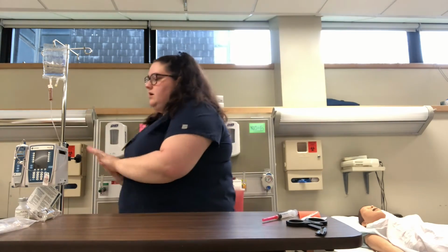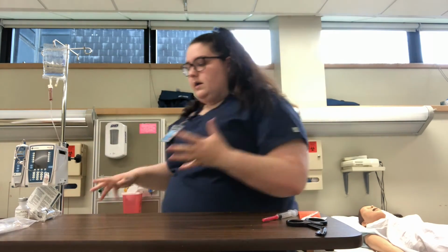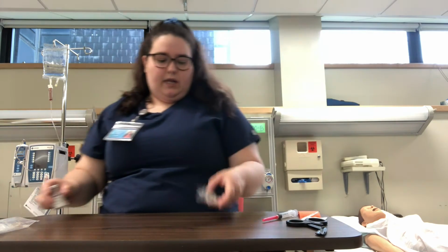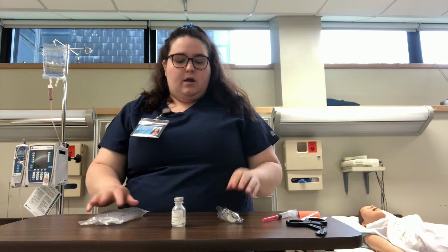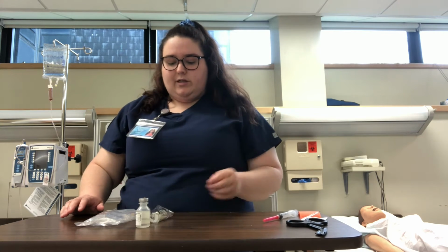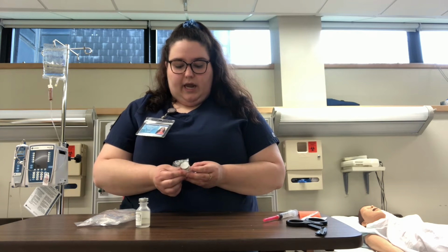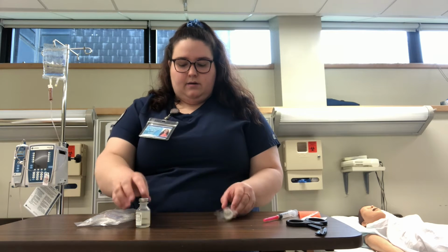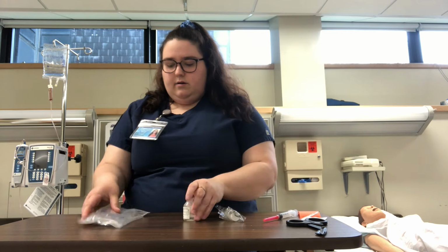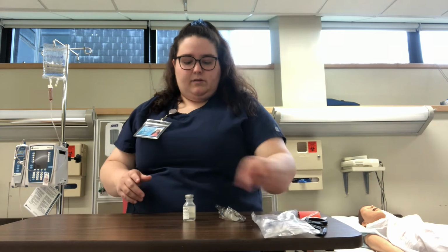Wash my hands, go to the med cart, take out the medications I need. I need the antibiotic, normal saline, and a bag of sodium chloride. I'm going to do my second check by comparing the dose and the medication to the MAR. I'm also going to check for expiration dates on everything. Okay, everything's good.